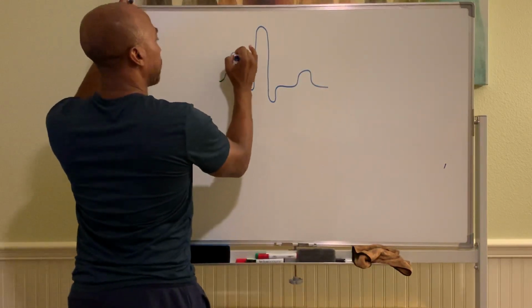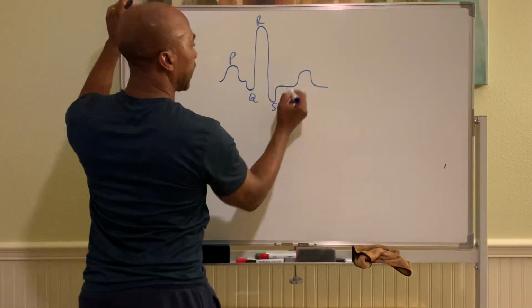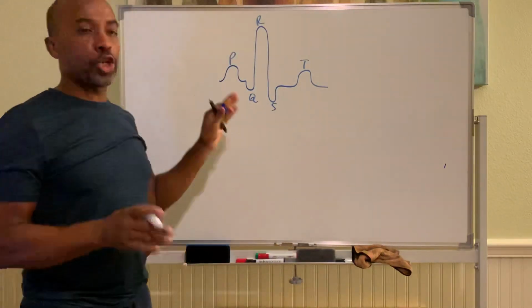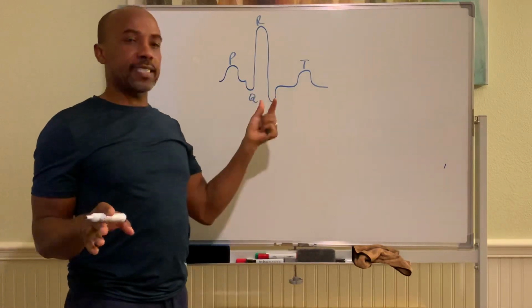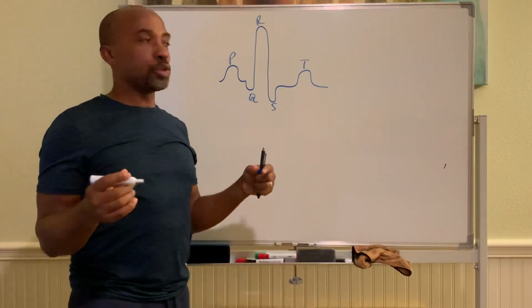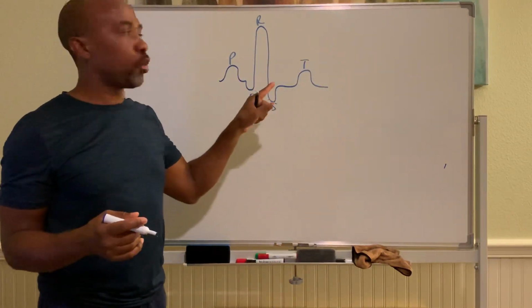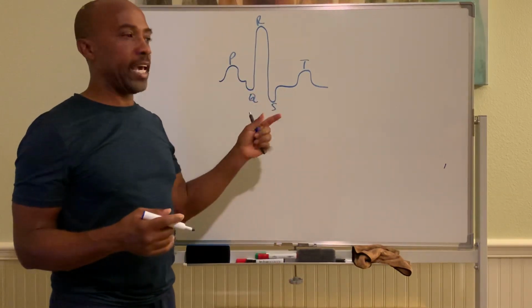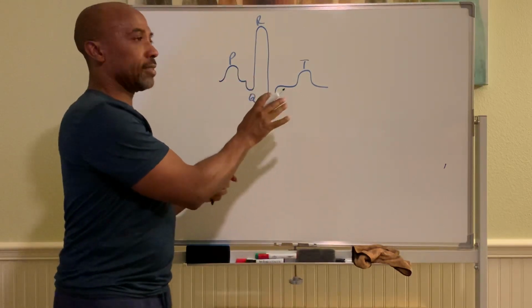Okay, P, Q, R, S, T wave. And here we'll show you two EKG strips, one from resting and one after exercise. And we're asking you to label the EKG for the resting one. Okay, label the different waves, the P wave, the QRS wave, the T wave, and some other segments which are in the lab. Label them there.